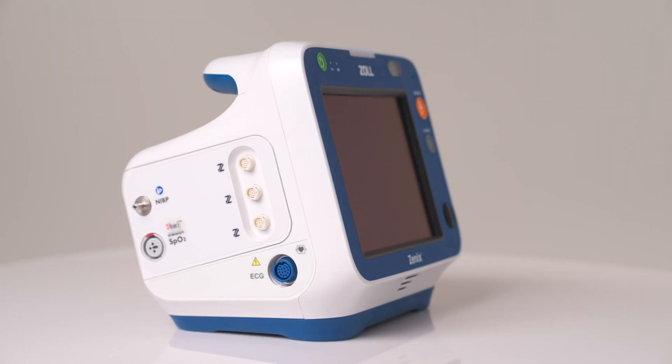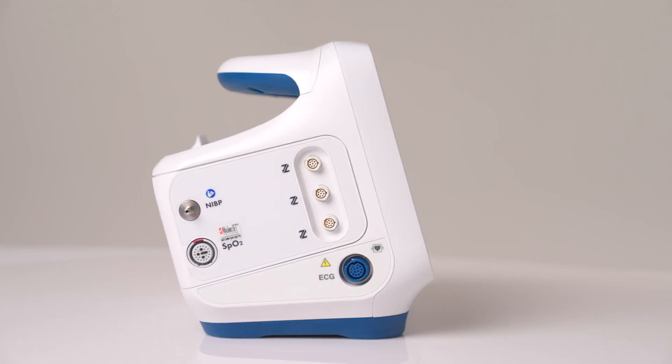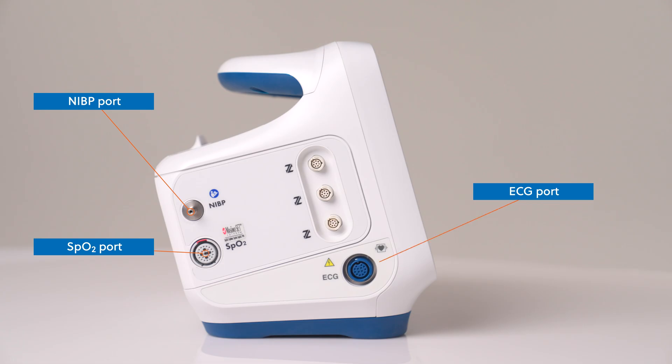Xenix is equipped with a variety of patient monitoring options. On the left side are three Z-Link ports that provide proprietary connections for invasive pressure cables, temperature cables, or the AccuVent interface cable. There is also a blood pressure connection, a pulse oximeter connection, and an ECG cable connection.